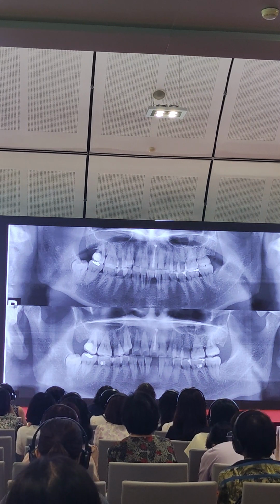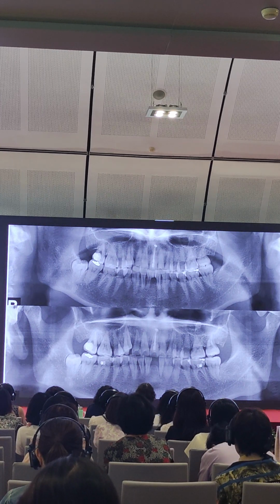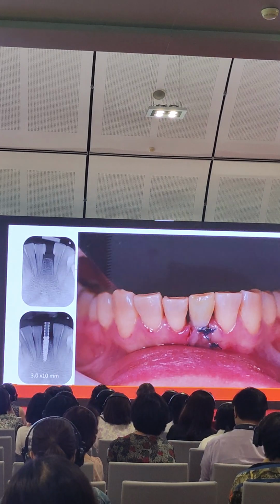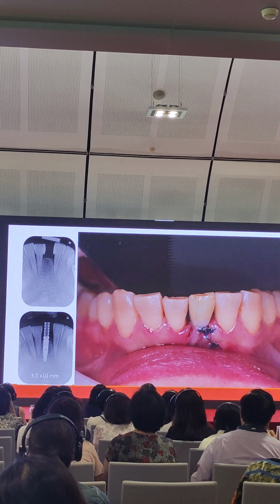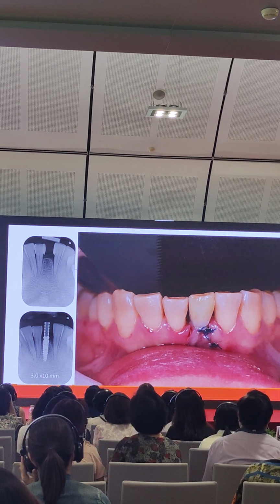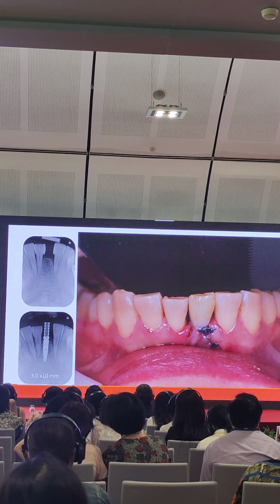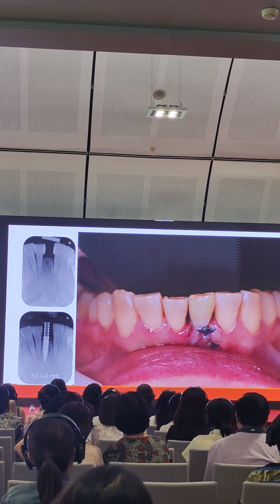So what do we do next? Now with that planning, we get the tooth movement initially after the first series of aligners. What should we do next? Early improvement. Okay, now we prepare the osteotomy site for an implant, so I did the implant. Okay, as a GP, I have always done it for 20 years. I put in a 3 millimeter diameter Nobel Active implant, and on the same day I placed a temporary crown. This is the temporary crown. I try to paint it because that made the tooth look better.